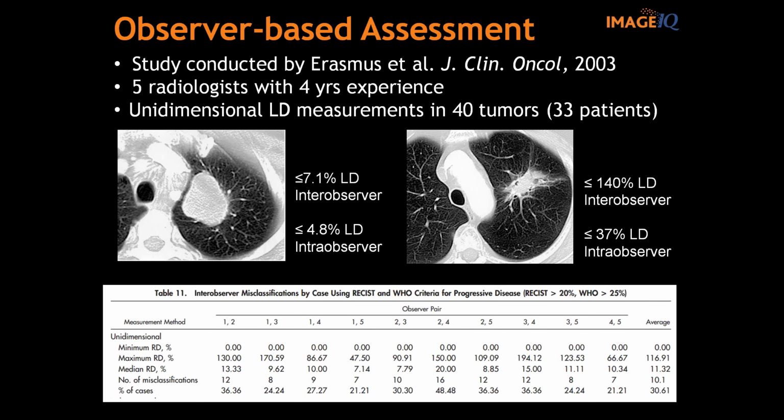It's hard to determine which axis, or which line, I should draw. What was neat about this particular study is that they went old school. Instead of letting the radiologists open these images on their PACS viewer and adjust window and level, they printed them out. That was fixed, so they didn't have the opportunity to change it, which would cause some variability in how you window and level. They had the images printed and let them use a ruler. They even showed the radiologists which slice to make the measurement on. That took a lot of the variability out of this.